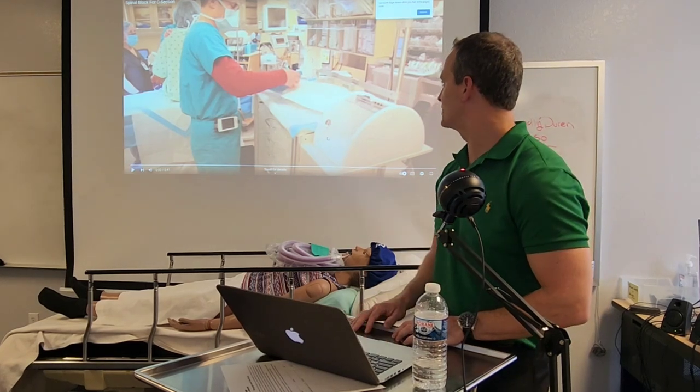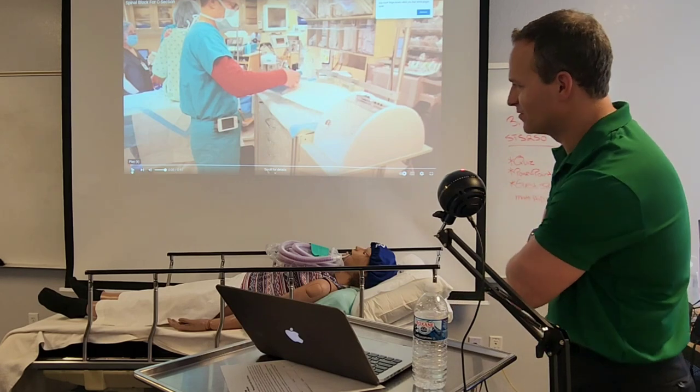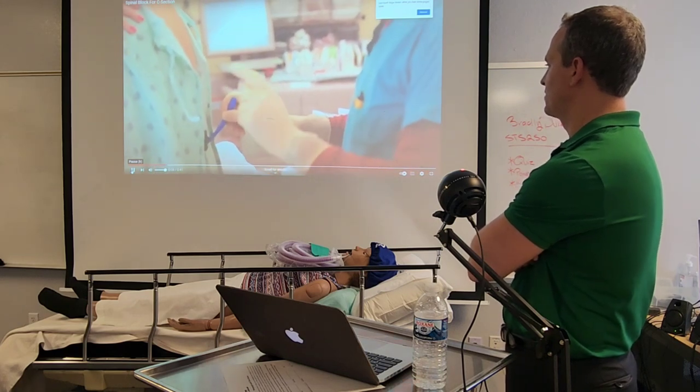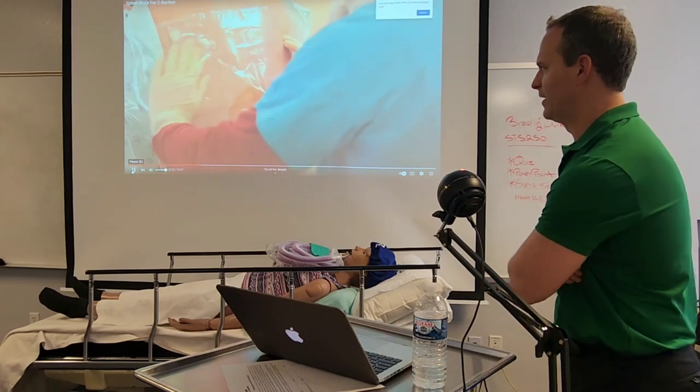So this is somebody placing the spinal, hopefully. It's kind of a short video, so I hope this is the one I want. And so he's scrubbing the back with povidone, or I think it's iodine mixed with alcohol.